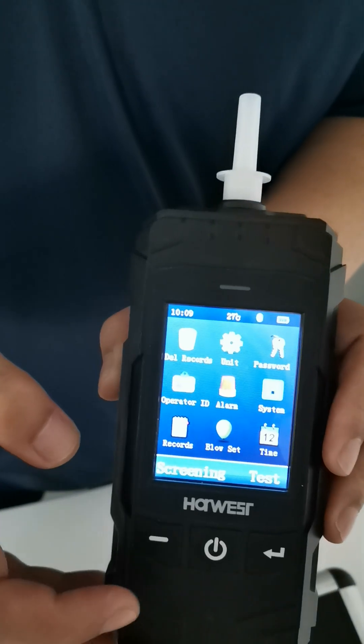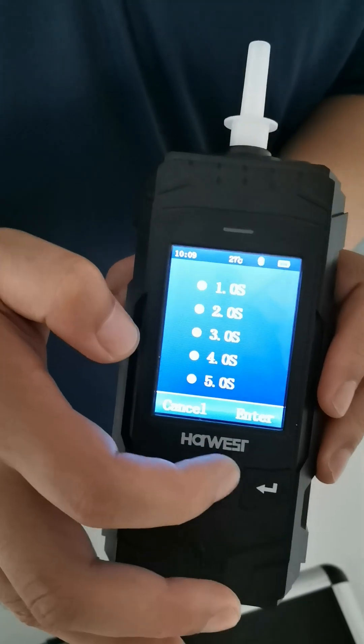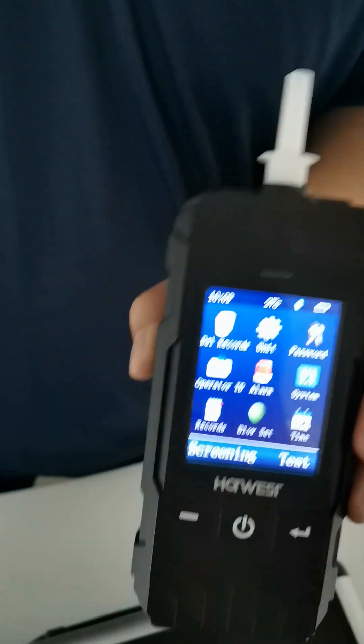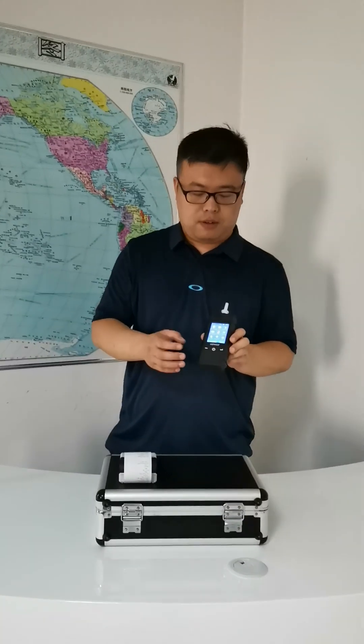Next one is records — blow time. Blow time can be selected from one second to five seconds. The last one is time — you can set your date and time. That's all for the model AT8801.